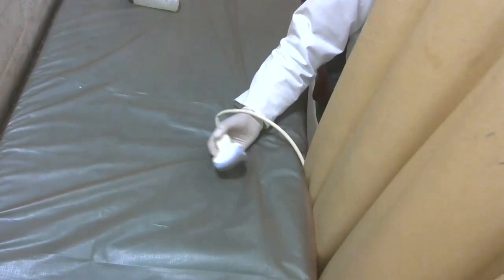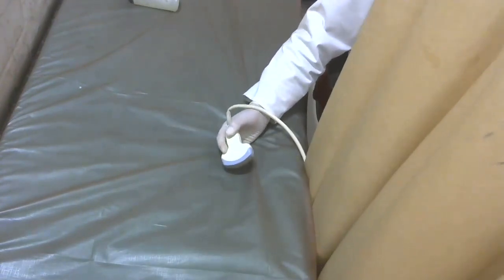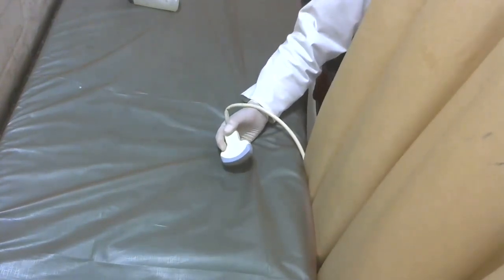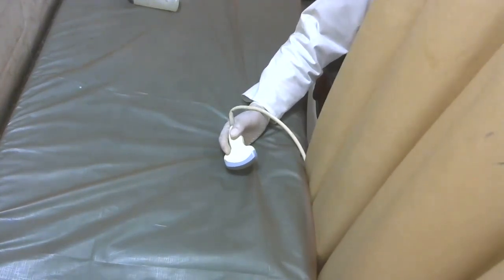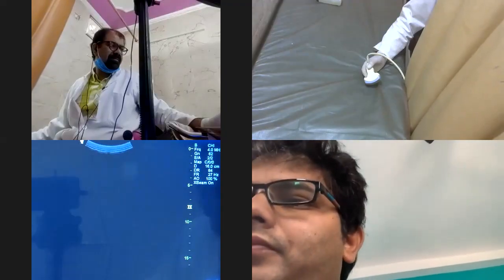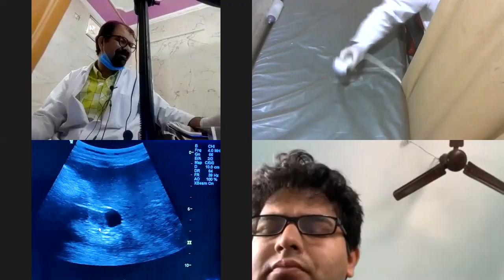Okay. So now we will take one more patient for your session. Yes, sir. Give the patient. So clear with this?